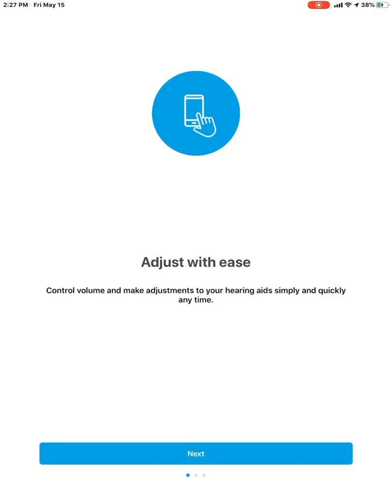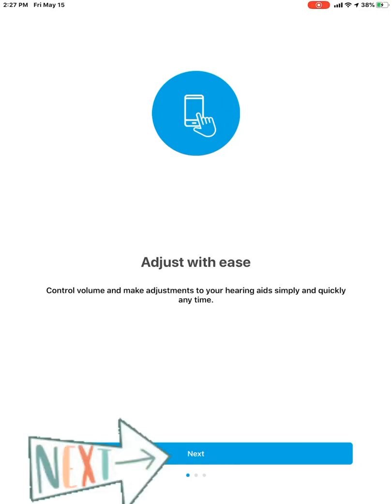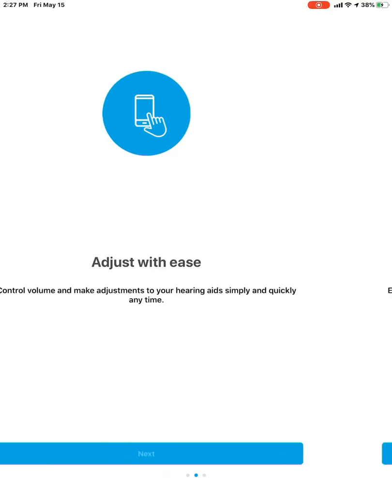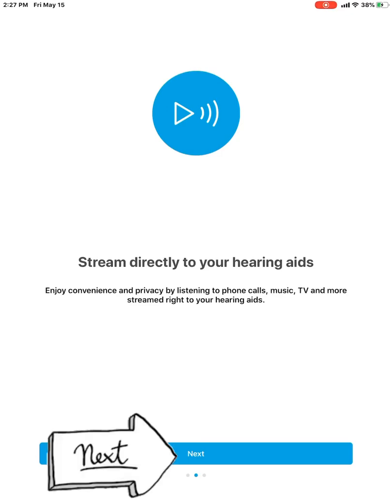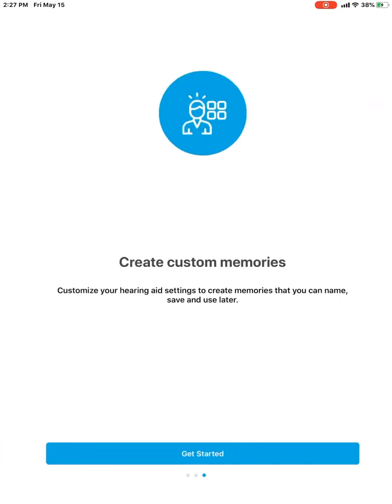And then it just talks about some of the features of the app about how you can adjust the hearing aids with the volume control. We'll hit next. You can do some streaming directly to the hearing aids if you're one to stream phone calls or to get on YouTube or listen to Pandora or any other types of music streaming. But we'll hit next.